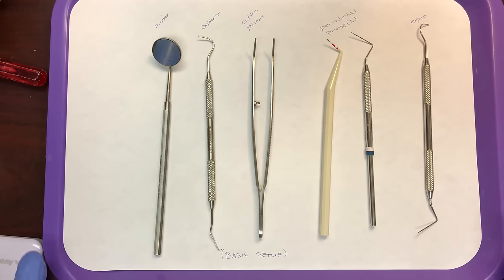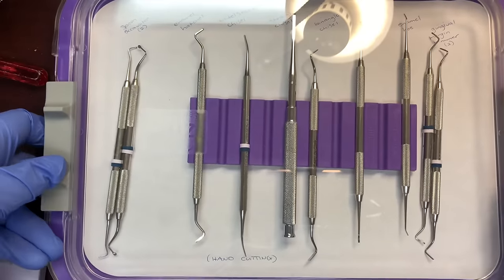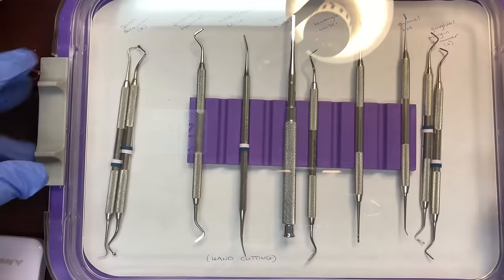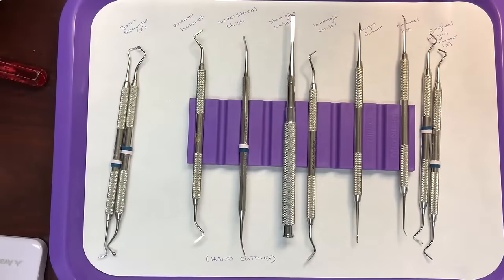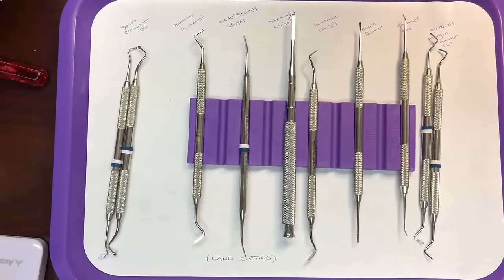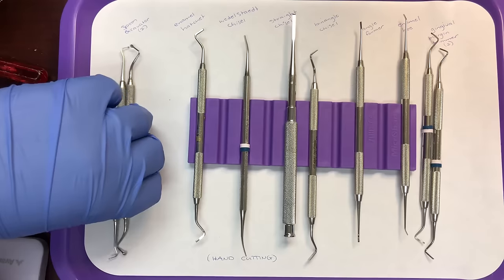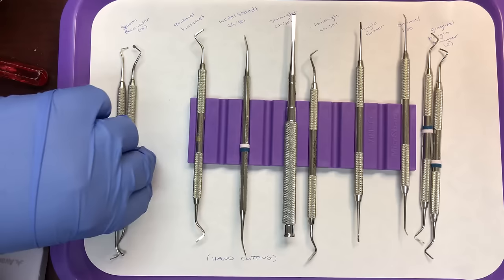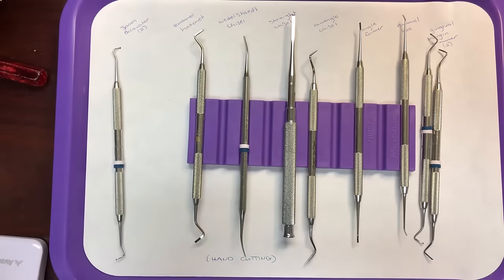Those are your examination instruments. For the hand cutting instruments, we have a variety here, and these are some of the hardest ones to memorize due to the small working ends — they tend to all look very similar.